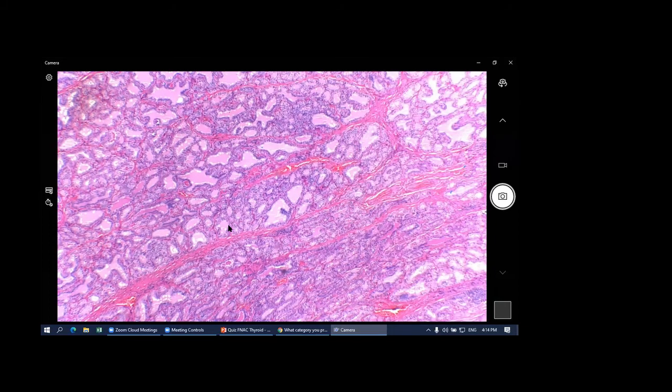Okay. The second last case. It looked like treated Graves. Huh? Histology? Yeah, looks like treated Graves. Yes, but they put it as hyperplasia, hyperplastic. The area I showed you is not entirely all hyperplastic, there is more hyperplastic, but I did not bring the slide from below.